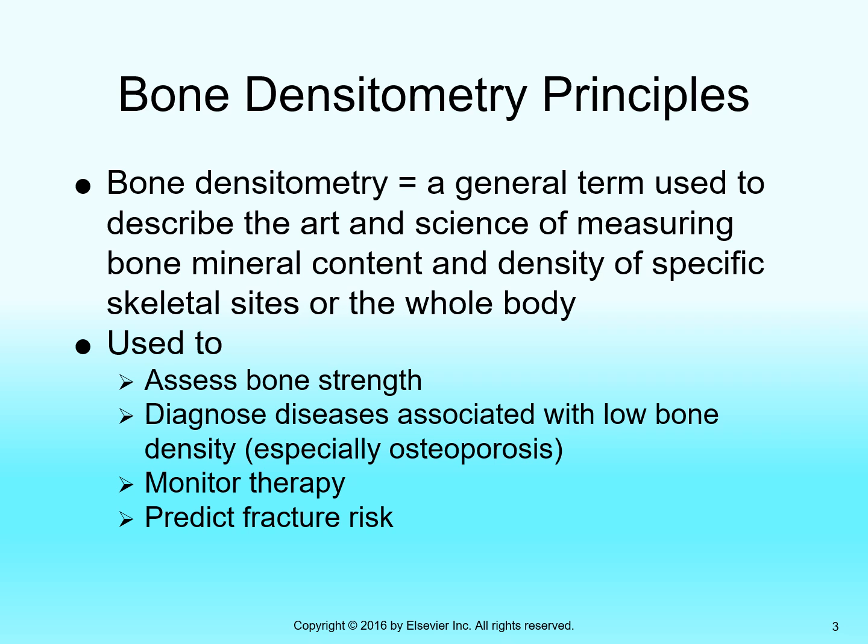The mineral content in particular is the calcium atom. And we can estimate calcium mineral content by measuring photoelectric absorption, or rather the difference between the photoelectric absorption of two exposures. We'll get into the science of that, the high energy and low energy exposure and the difference of those, a little later in the lecture, but that's how we're doing it.